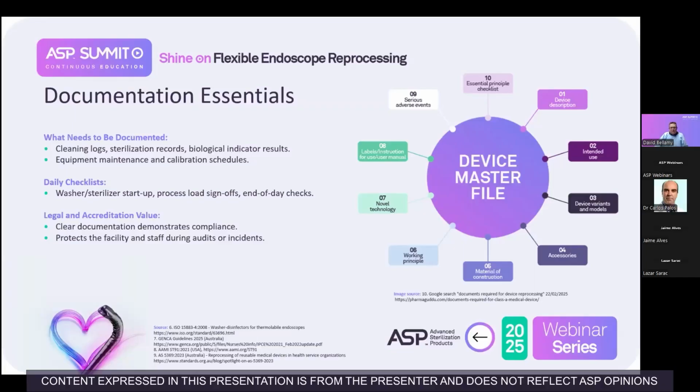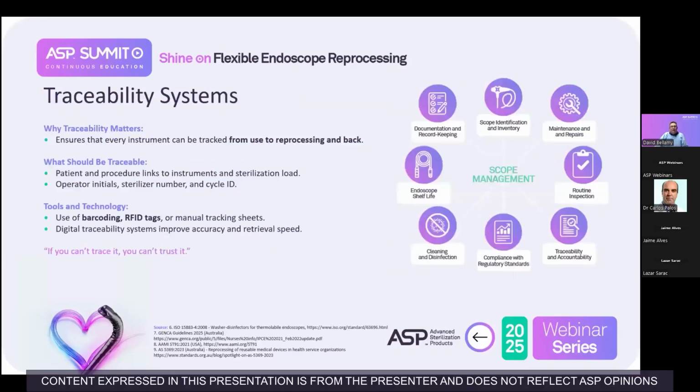And then, of course, it comes down to legal and accreditation values. Clear documentation demonstrates compliance and protects the facility and staff during audits and incidents as well. And finally, going into traceability systems.